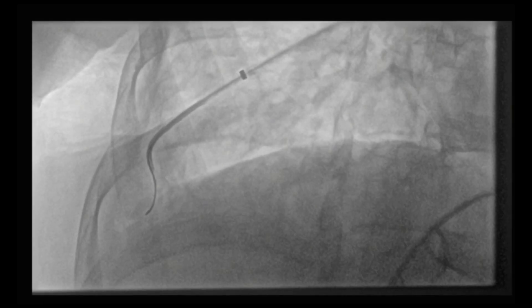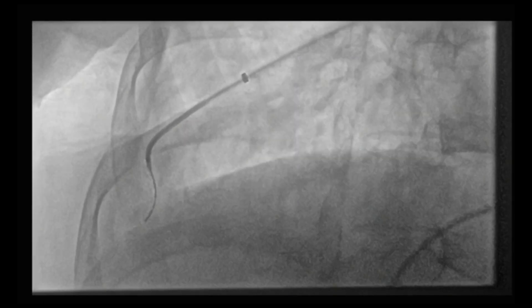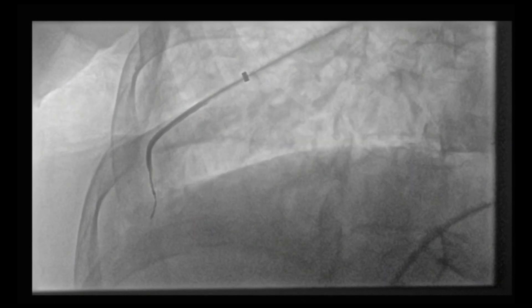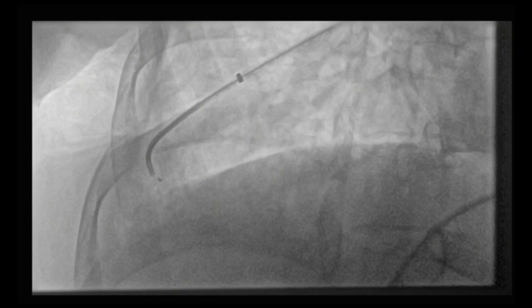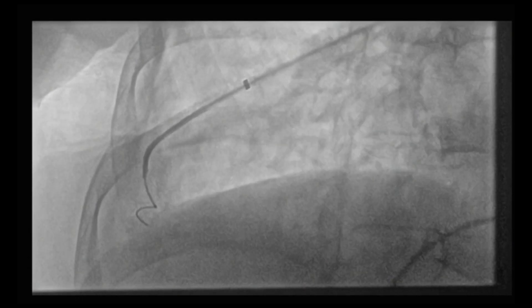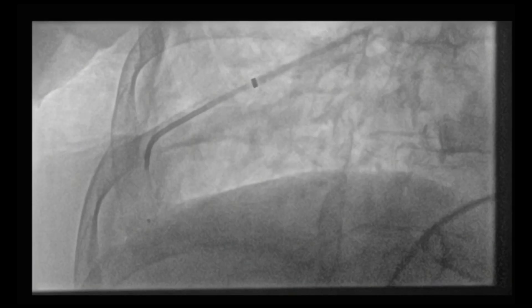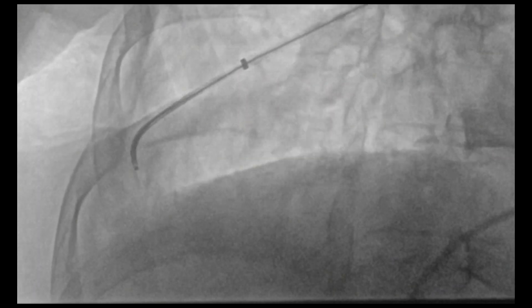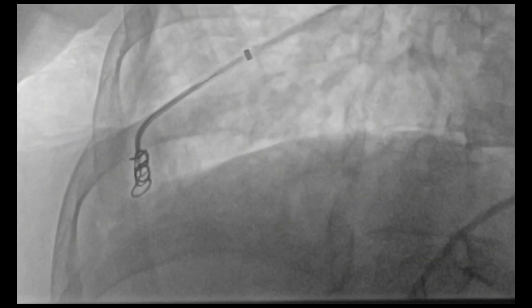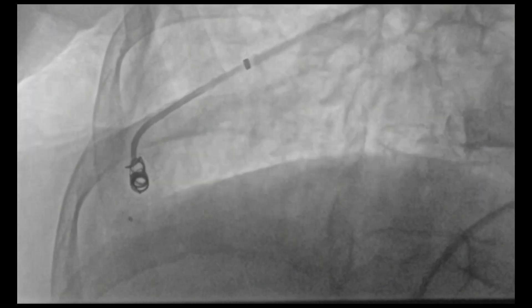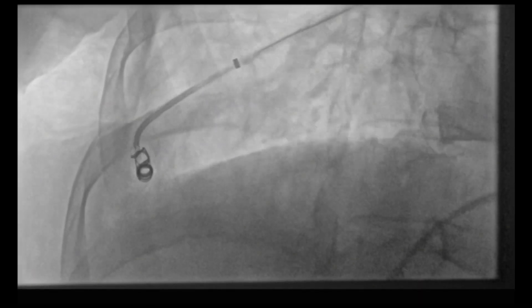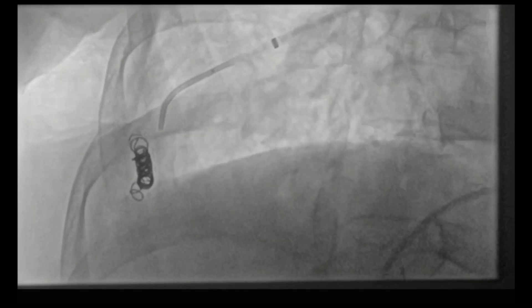Next, a microcatheter is introduced into the lower branch. Based on our measurements, we decided to perform coil embolization of this lower feeding branch into the pulmonary AVM. Once the microcatheter was advanced into this branch, we introduced our 5 mm x 15 cm interlock coils into this arterial branch. We used two coils. A repeat pulmonary angiogram was then performed after coiling of this inferior branch feeding the pulmonary AVM.